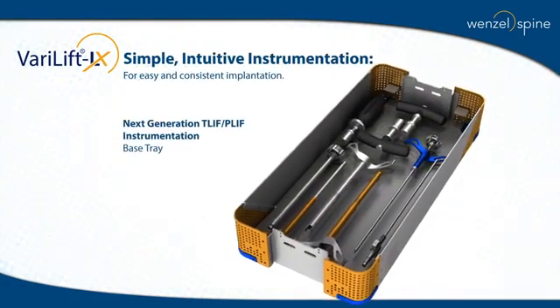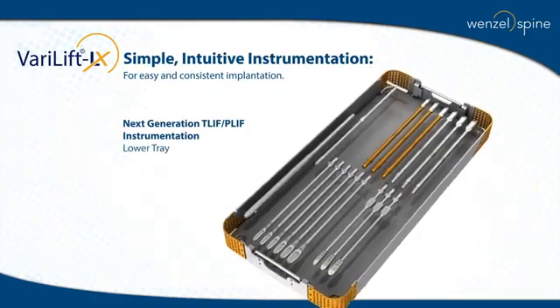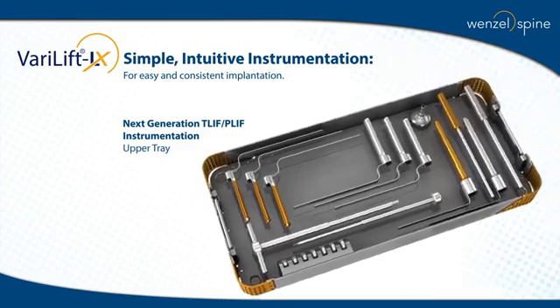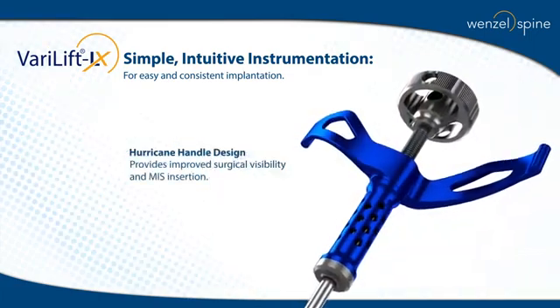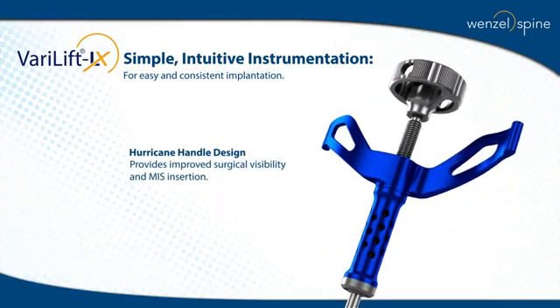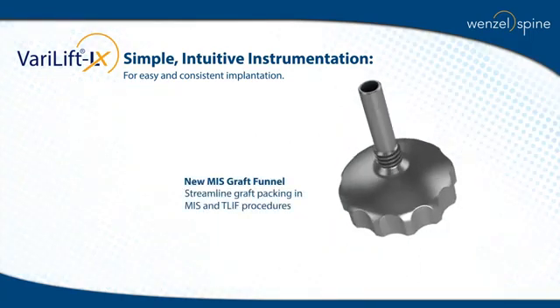Verilift was designed for a T-LLIF or PLIF approach with simple, intuitive instrumentation requiring only a single tray, helping reduce clutter and time spent in the operating room. The hurricane handle improves surgical visibility and MIS insertion for easy and consistent implantation every time.